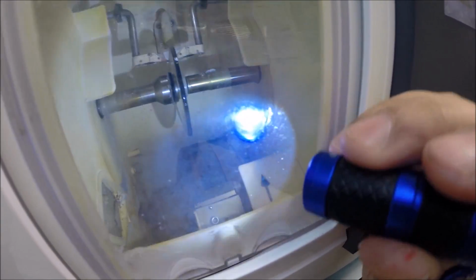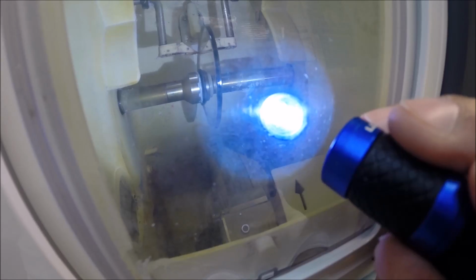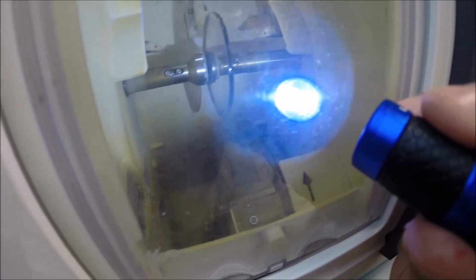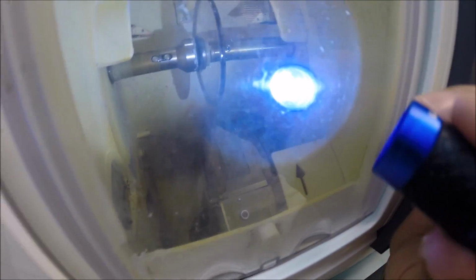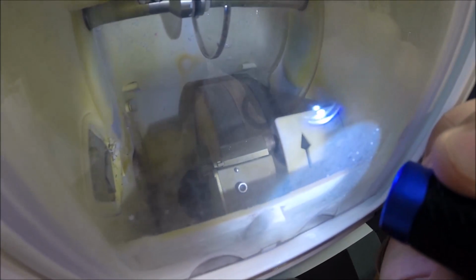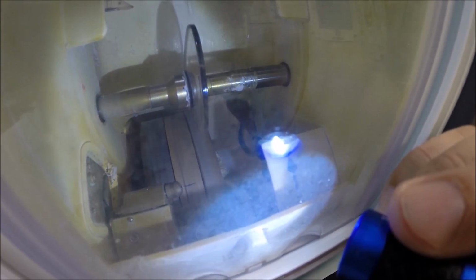Normally I take the door off and clean it with Rain-X so you can watch it, but the screw that's in here is stripped and I can't get that out to clean the door, so you're only going to get a partial view. So the lens was traced to make sure it's large enough to fit into the frame. The cutting wheel begins to spin. It's going to move into place and the wheel is going to drop down. The lens is going to drop down on the cutting wheel.